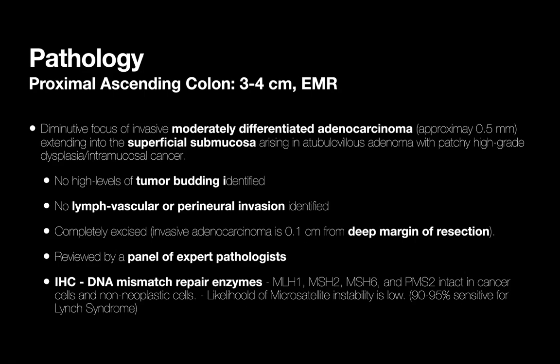So Roy and Sylvia, do you want to comment on the path? I think the invasion is indeed very superficial. If anything, it's really at the bottom of, or the deeper side of, the muscularis mucosa.